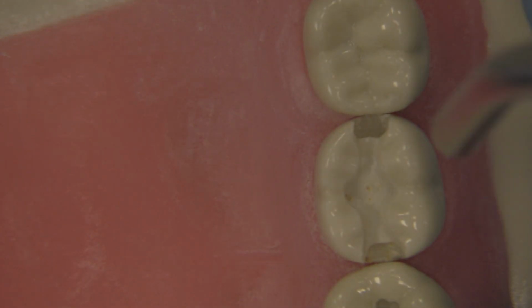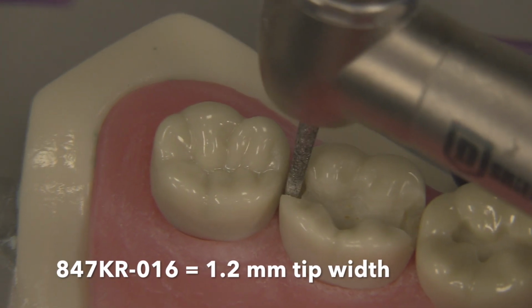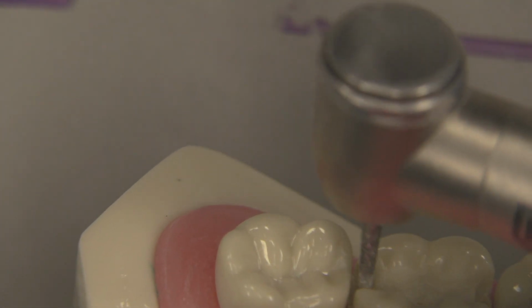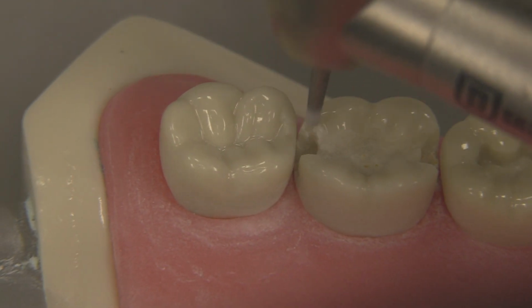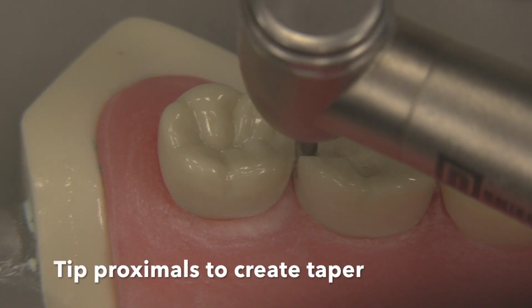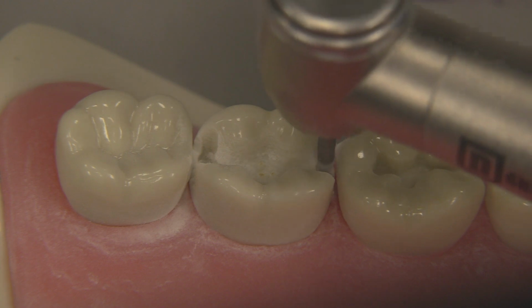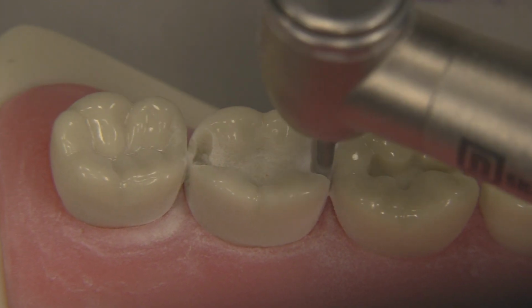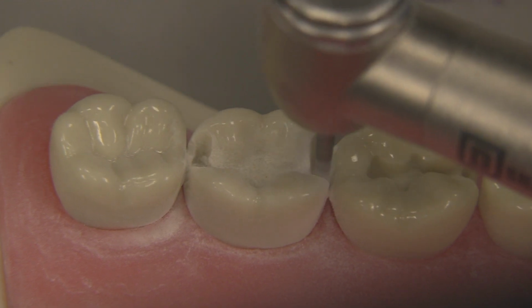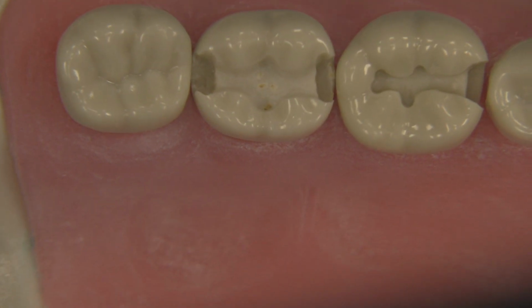Once you've got that part done, with the burr here, you can try to use this in the box if your box is big enough. You notice that the box is pretty big. It allows for us to get the burr in here. That's a definite advantage to prepping it a little bit more aggressively. And we've created a few funny little wings here, and we're just going to use the off-angle chisel to snap them off.